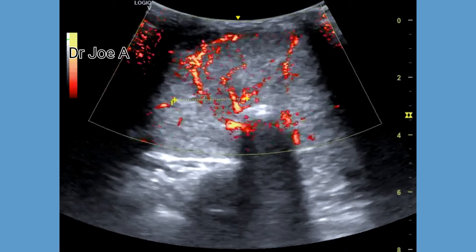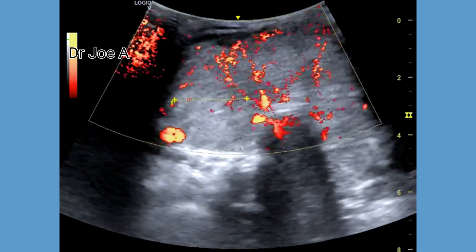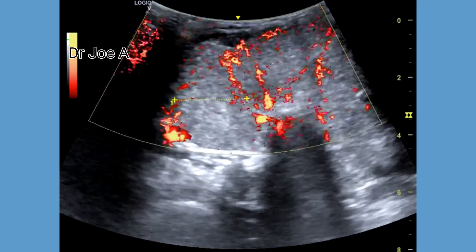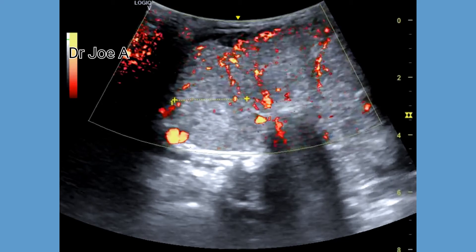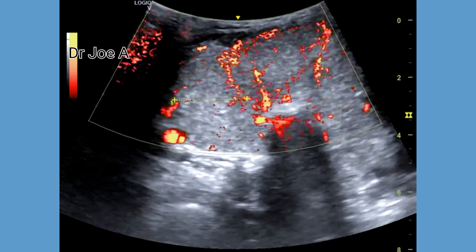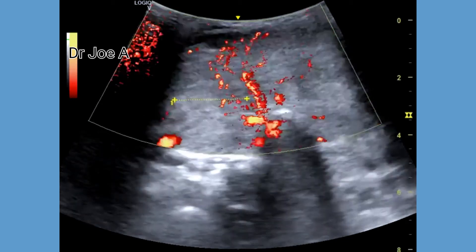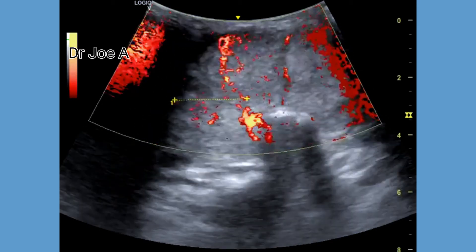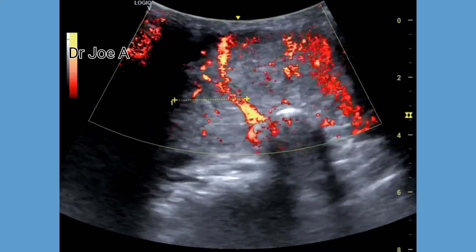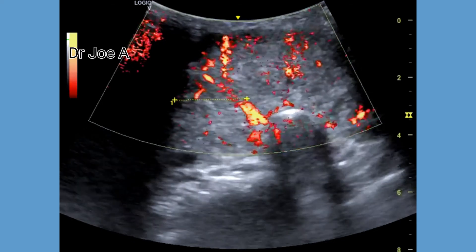Power Doppler ultrasound shows increased vascularity of the thyroid, with a rim of vessels surrounding most of the nodules within the thyroid gland.